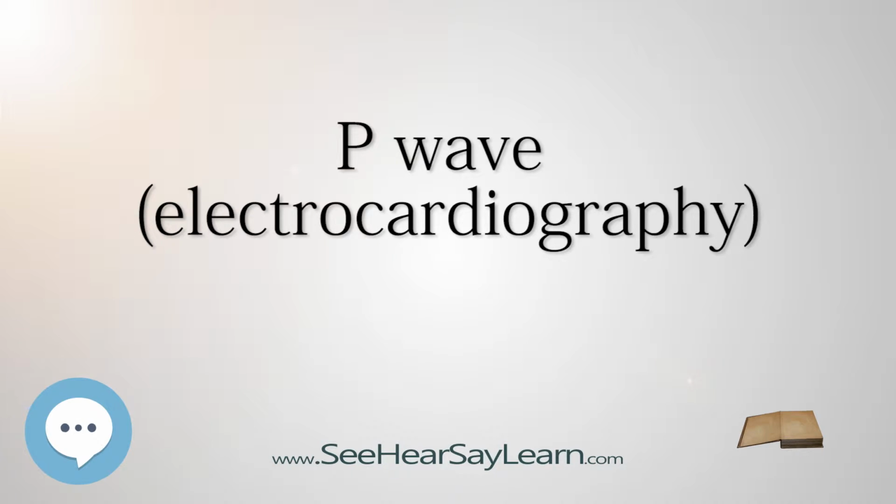Depolarization originating elsewhere in the atria, atrial ectopics, results in P waves with a different morphology from normal. Pathology. Peaked P waves, greater than 0.25 mV, suggest right atrial enlargement, cor pulmonale, P pulmonale rhythm, but have a low predictive value, 20%. A P wave with increased amplitude can indicate hypokalemia. It can also indicate right atrial enlargement.